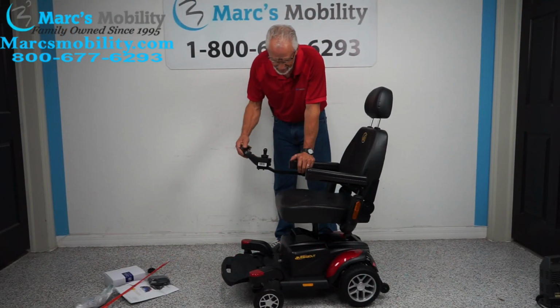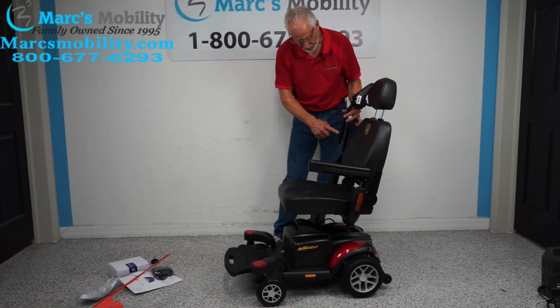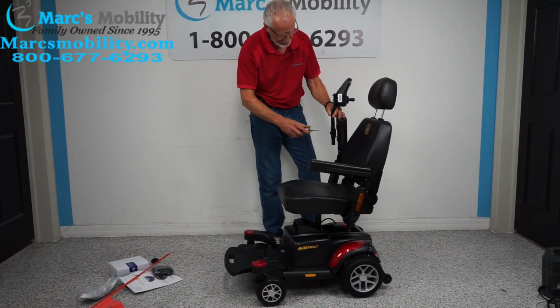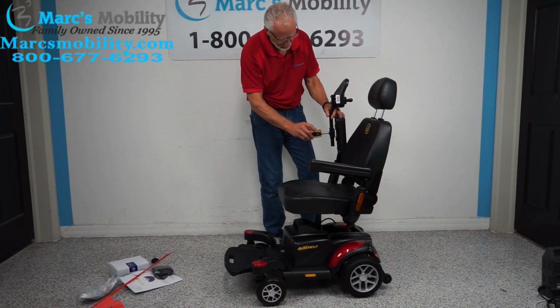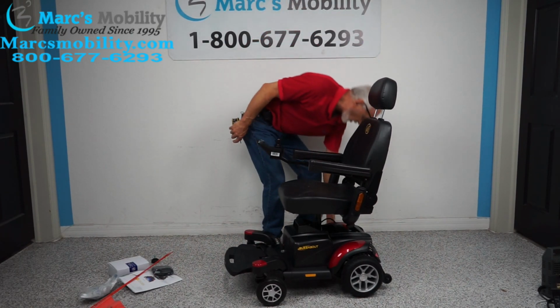All right, folks, we're back at it now. So there was a little screw under here that was missing. That's the one you use an Allen wrench for, and you can see how it's loose. It's an Allen screw. It goes in there, and then you tighten it real tight. It takes all the play out of the arm.